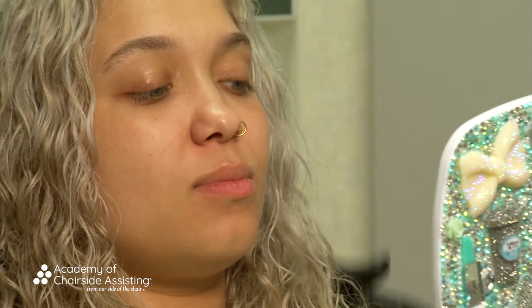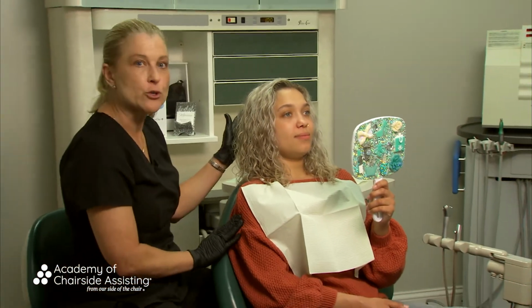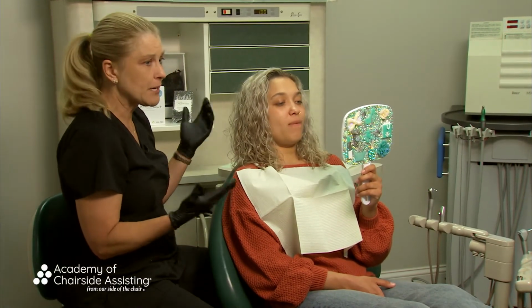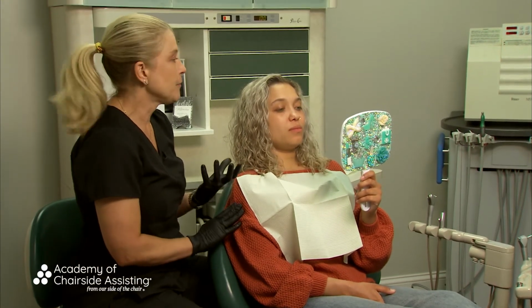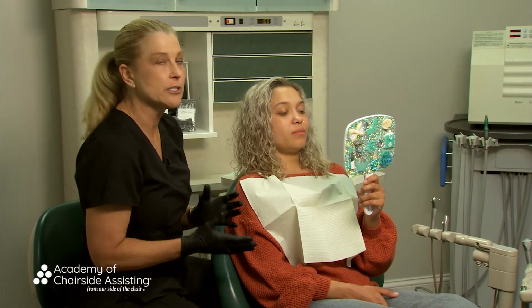Now, the one thing that I will say is that I like it when patients are laid back just a little bit because we're sitting forward. What comes forward? The saliva, right? So I always tell patients, hey, when you're doing this, watch TV. You don't want to go and work out. You want to just kind of sit and really just take some time to yourself. Because this really only needs to be in her mouth about 20 minutes. It says in the directions 15 to 20.